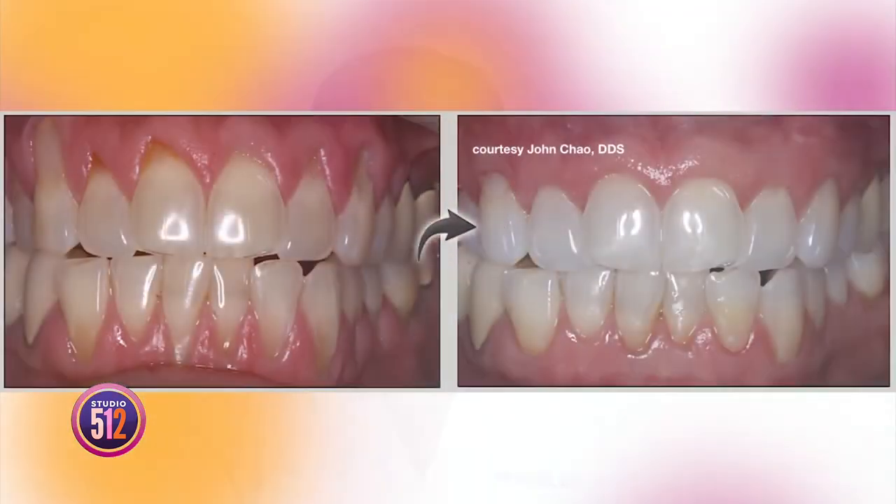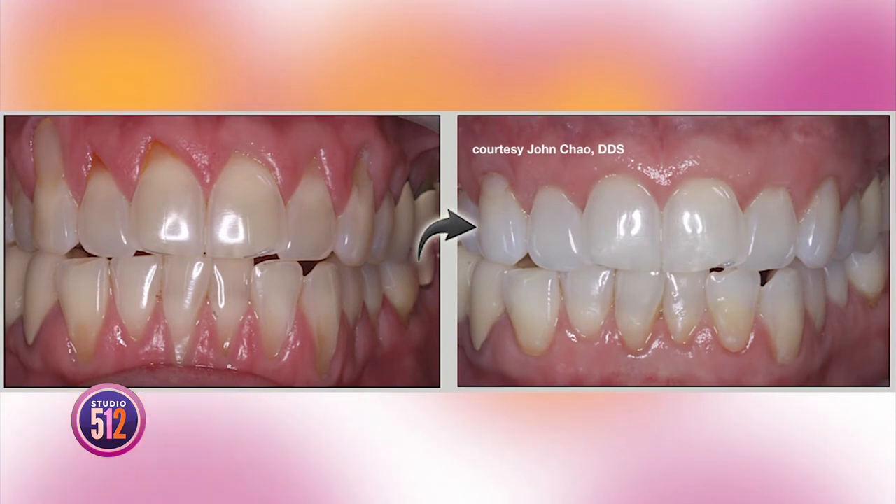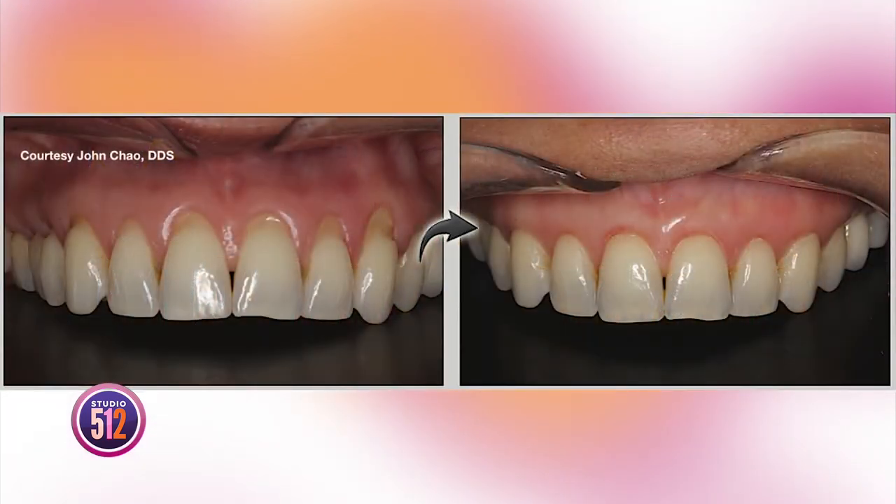Let's return to the patient experience. I had a lot of dental work as my teeth were maturing, and sometimes it was painful. With pinhole gum rejuvenation, patients love the results and the overall ease of the procedure. They appreciate seeing instant results with the gum line in the right place, in the same appointment. The entire procedure takes minutes per tooth. It's really a breakthrough.